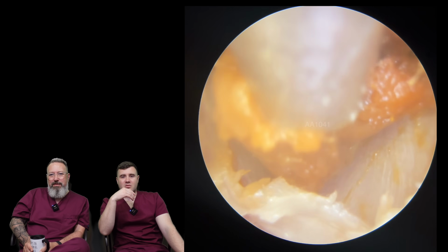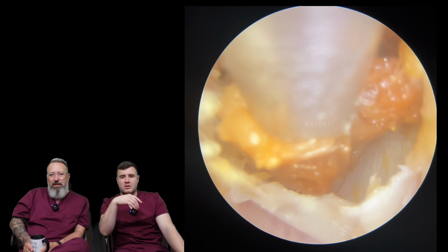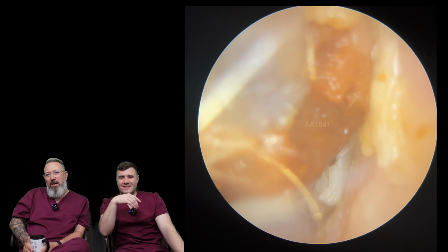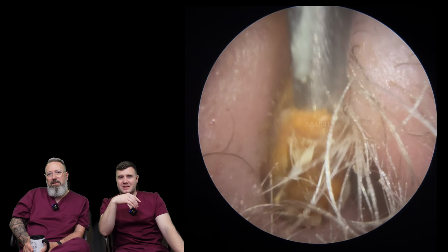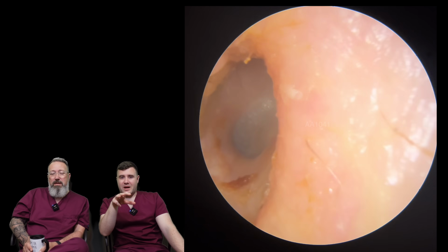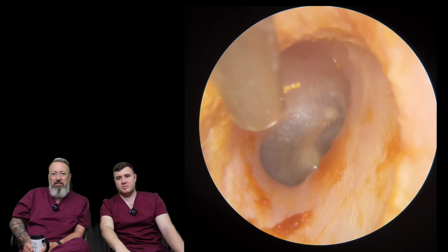Yeah. Oh, here we go. Just trying to hold the grip there. I can't tell whether that whole thing is moving or whether it's just that bottom section that's come away. Oh, it's taken away some of that softness, but quite a big piece there. Oh, look at that. There we go. It's come away cleaner than what I was expecting. There's a couple of little bits around the edges here. Again, blockage has been cleared.